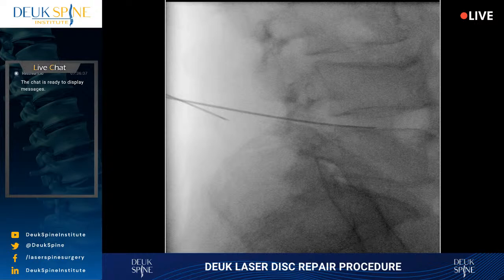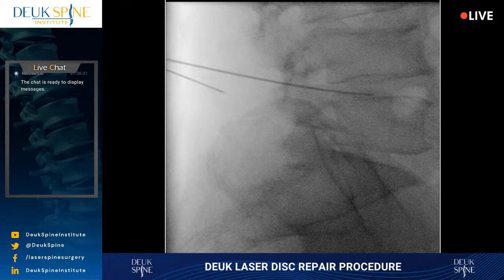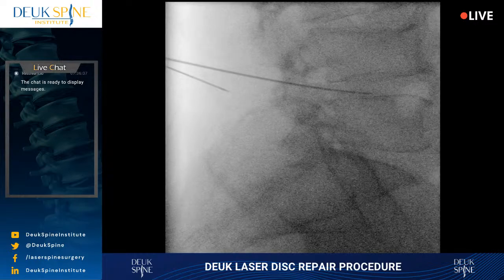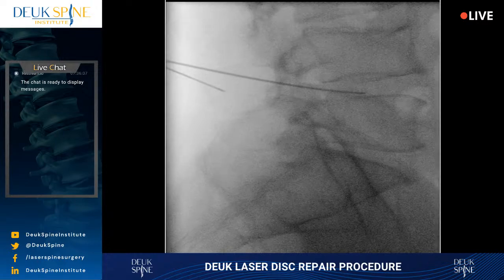I think you need to wag 1 degree because the pedicles of L5 are not lined up perfectly. So let's get the pedicles of L5 and the end plate of L5 lined up, the inferior end plate. Pick one way or the other. Take a shot. I don't know. Does that look better to you, Luis? It kind of does, but I think we're off orbitally. If you look at the pedicle, we're off orbitally by about 1 degree. So what we're changing is the wag and the orbit of the fluoro, and then we're also translating along the floor. I still think we're off orbitally, but I can't tell if it was better or worse. I wasn't looking. Go ahead, do it again. I think that's better. Try a little more.